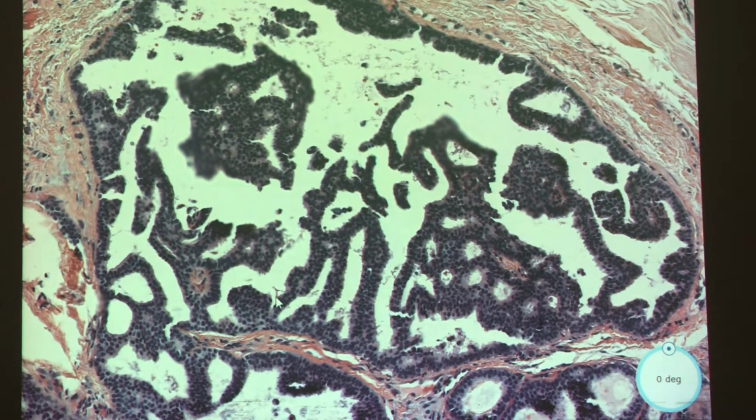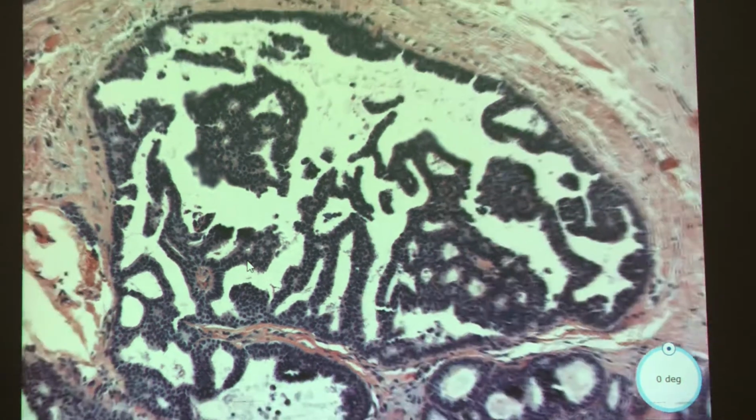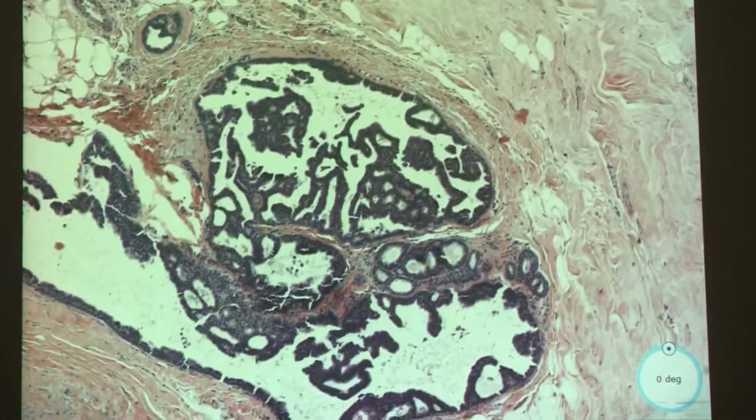But so we look at the overall sameness, architecture, right, like pleomorphism. We look at, are the nuclei relatively the same size? And like you said, the necrosis, mitotic figures. So we take all of that into account with DCIS. And this is pretty bland as far as things go. So I think your idea of low grade DCIS is a very good one.